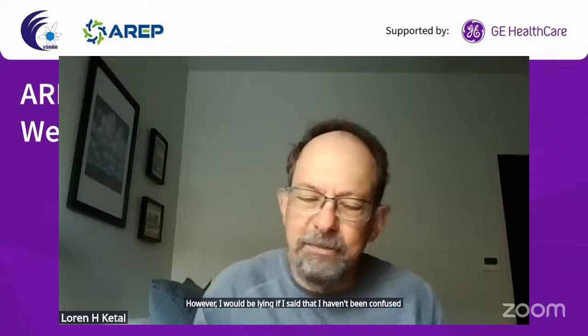In terms of the giant bulla, one of my first professors told me that smart is good, but old X-rays are better. So often, the first thing I'm doing is looking hard for any prior imaging, even if it happens to be an abdominal study, to see if there really was something there before. That's, of course, the best thing to find. Infected bullae tend to have thinner walls, and the inner walls tend to be smooth as compared to an abscess. However, I would be lying if I said that I haven't been confused in some cases and really not known which of those I was looking at.